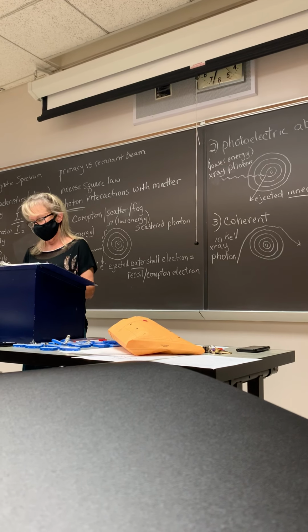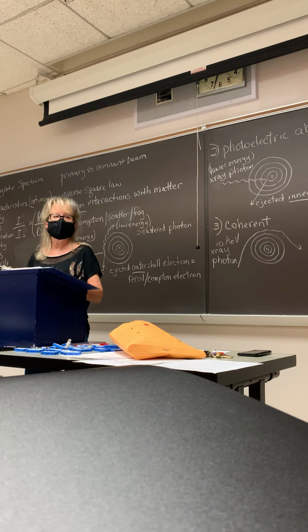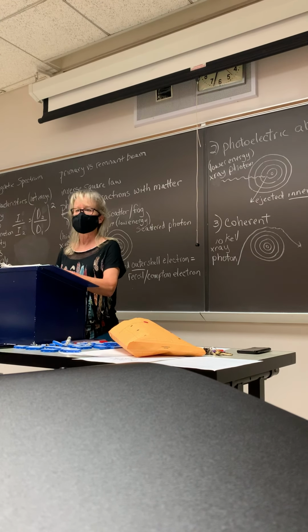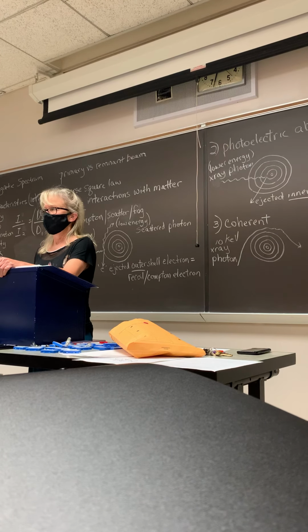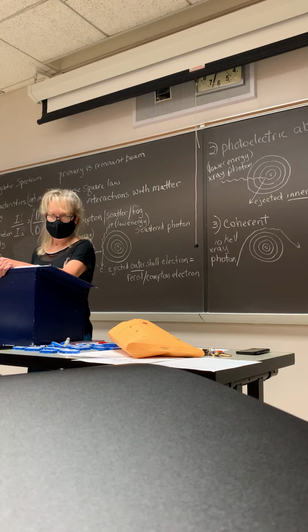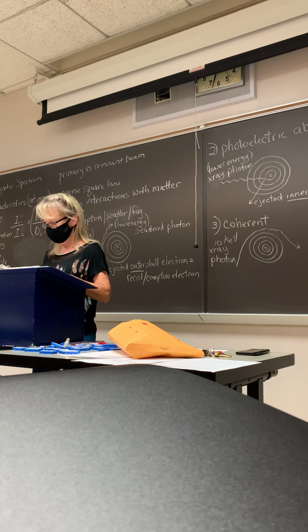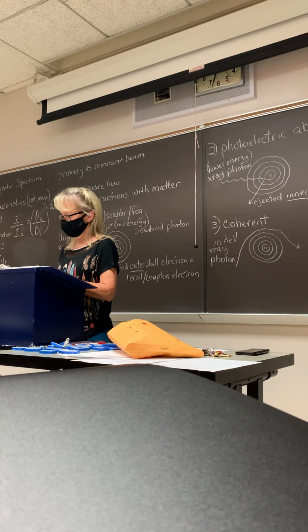Right, patient considerations, pediatrics. If I skip something, it's because I'm not going to ask you it. For pediatrics, you should always remember, don't use a grid on a PD. Why not? Yeah, it's a lot more dose, because with grids, you have to increase your mAs. So don't use a grid for PDs.